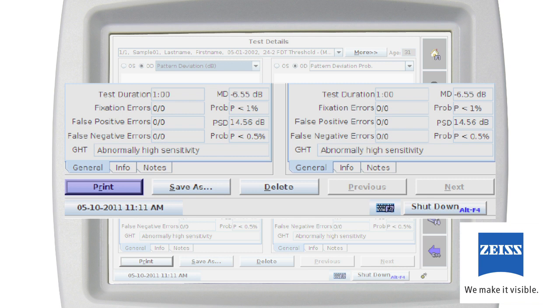You can recall or modify any notes or test information entered during testing. After viewing, you can select print to obtain a printed result, delete to permanently delete the test, or save as to save the test.